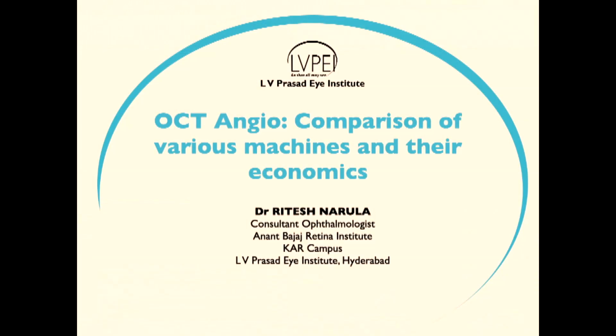So our first speaker is Dr. Ritesh Narula. He works in LVPI as a senior consultant, and because he has access to all the machines available in the market, he'll be giving an overview of which machine you have to choose and which machine will give the best results and what the economics of these machines are. So Dr. Ritesh Narula, please.